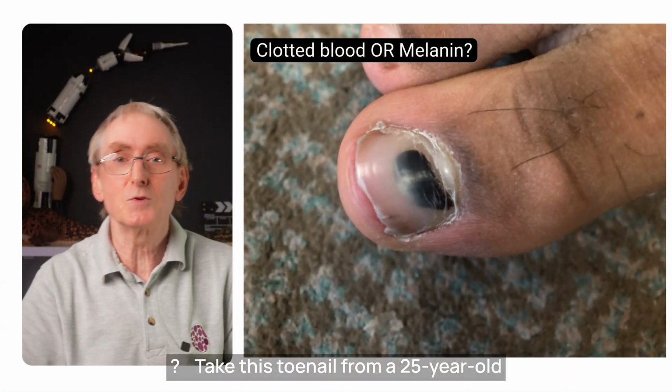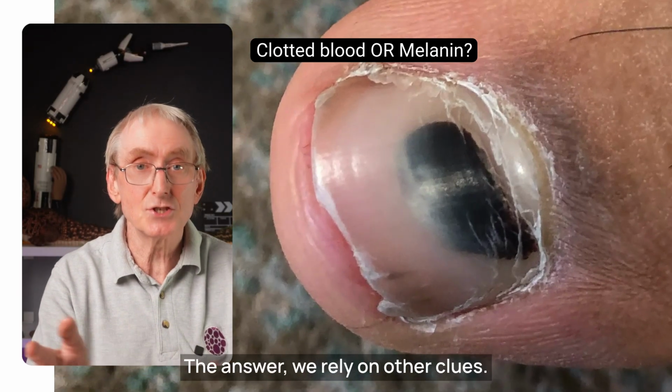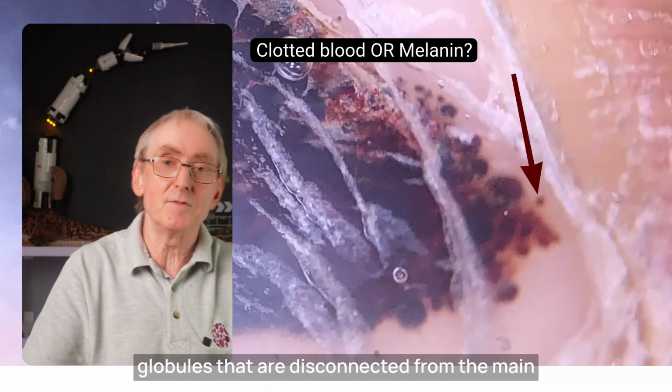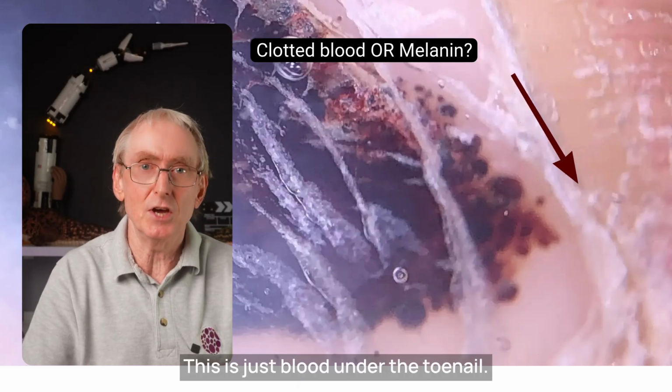Take this toenail from a 25-year-old patient who came to see me. Is this a melanoma? The answer? We rely on other clues. In this case, the periphery shows red-brown globules that are disconnected from the main pigment, along with a gap from the nail matrix. This is just blood under the toenail.